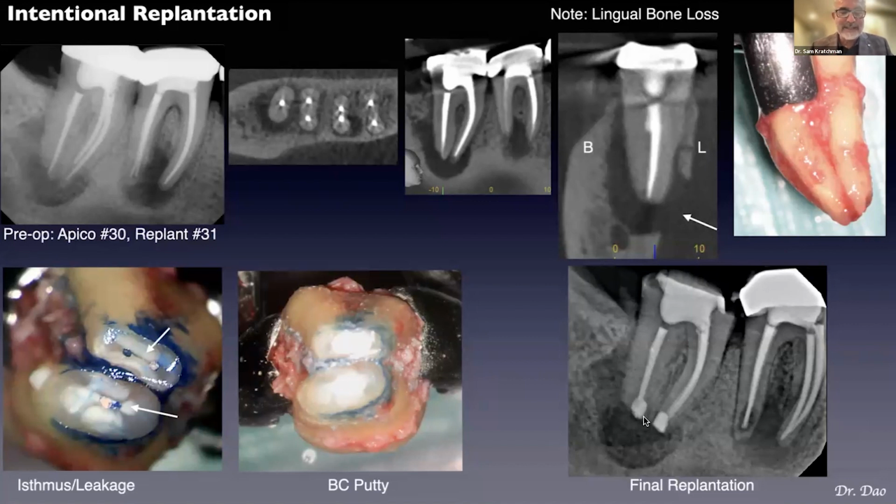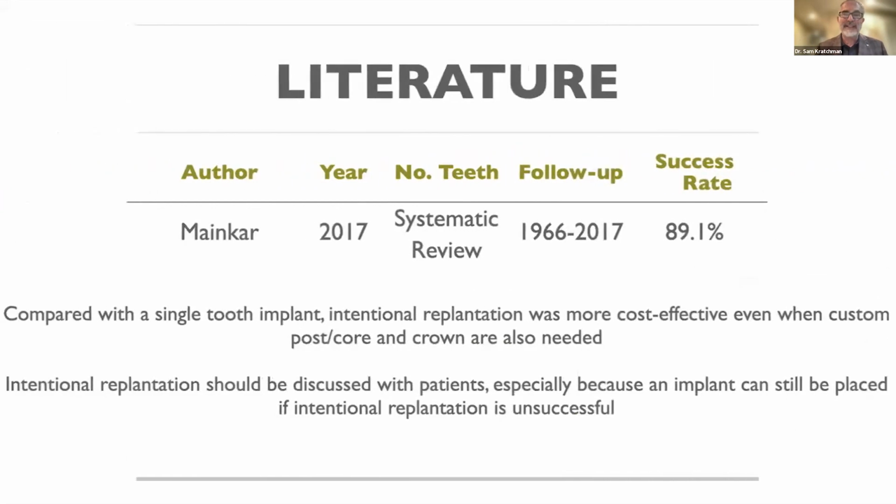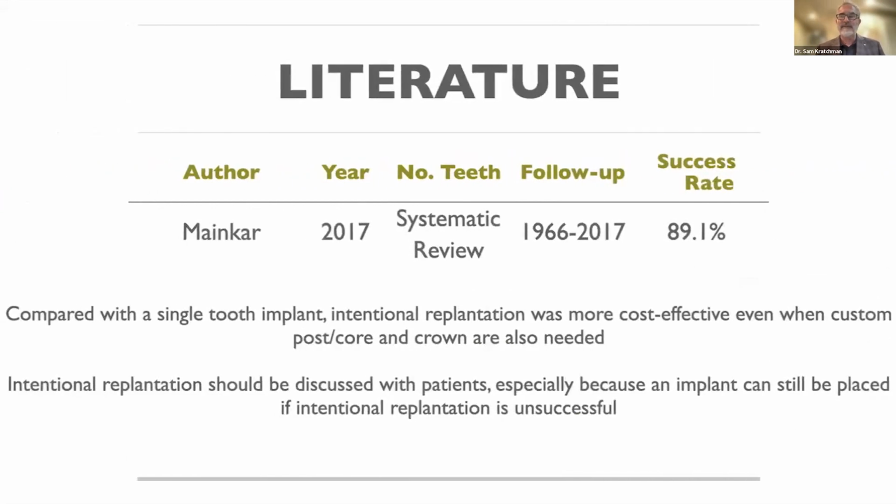I have so many cases, I'm sorry, I don't have time to show you, but here is the success rate. Dr. Torabinejad, who's a famous endodontist out in Loma Linda and chairman there, did a review of articles from 1966 to 2014, with an 88% success rate on reimplantation. And then in 2017, Mainkar also did a review, 89% success rate.